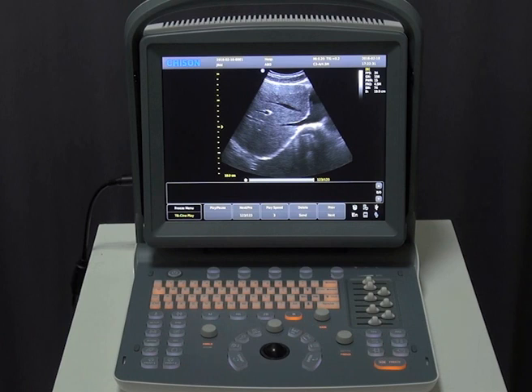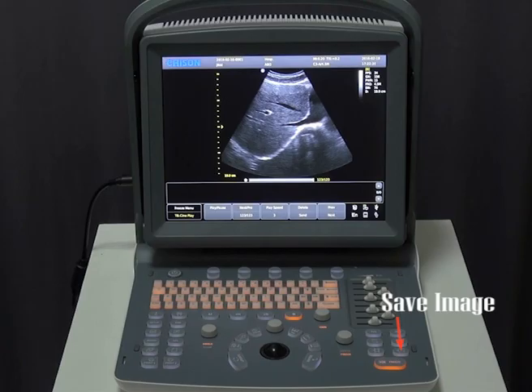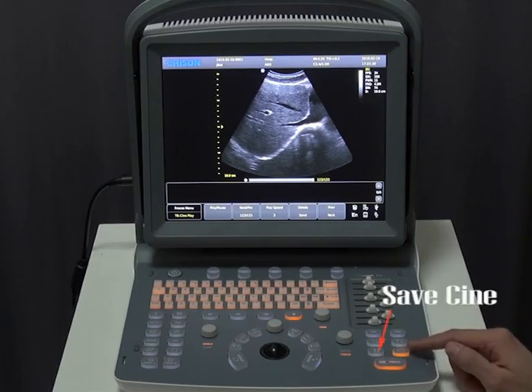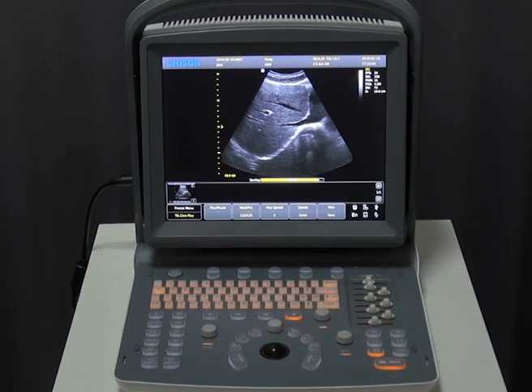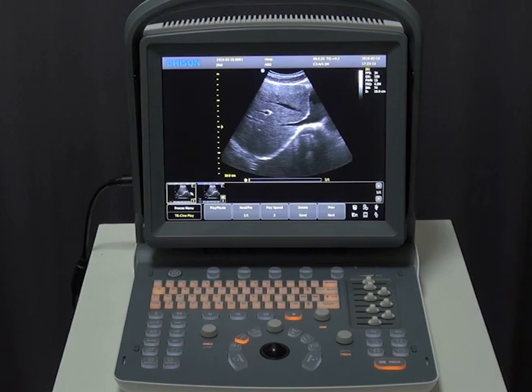After the image is ready, press one key to save the image. We can save images in real time. For Cine, you have to save in frozen status. If you want to recall, hit the cursor button, move the cursor to the desired image or Cine, and click Enter.